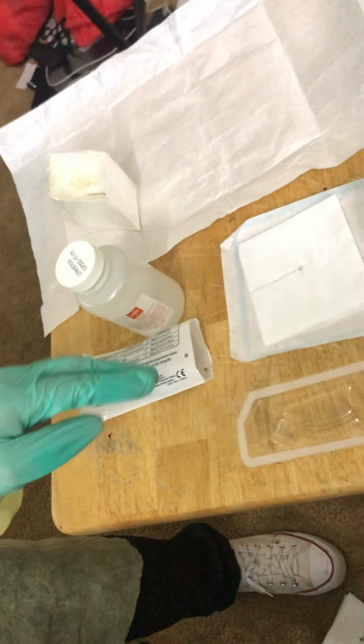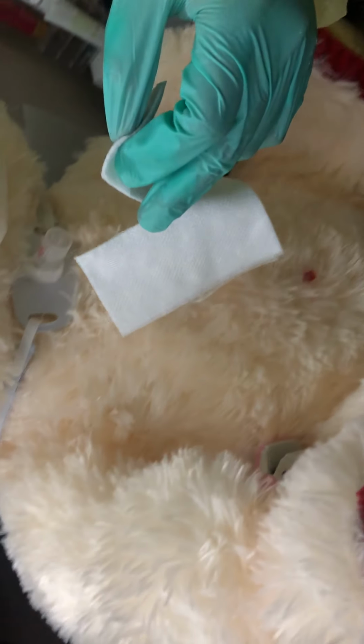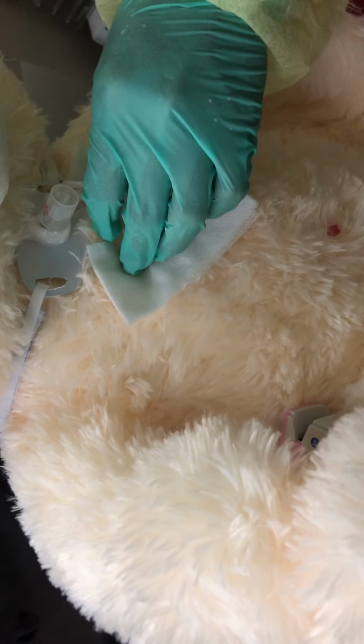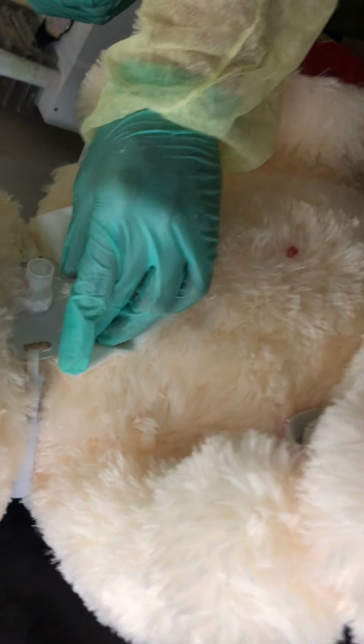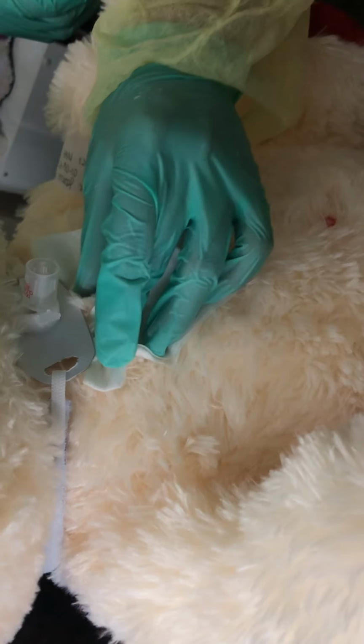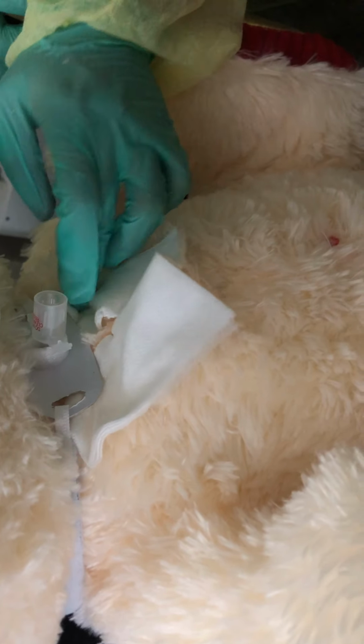I just got to put the non-raveled or the slit dressing. So at this point, I don't have to worry about sterile field besides this. Here we go. I want to make sure it fits within my slit, and I want to make sure I don't leave any creases.